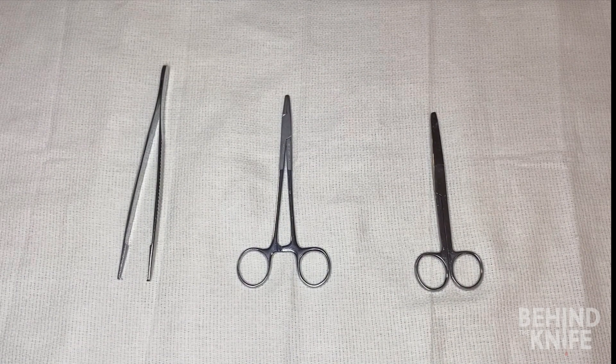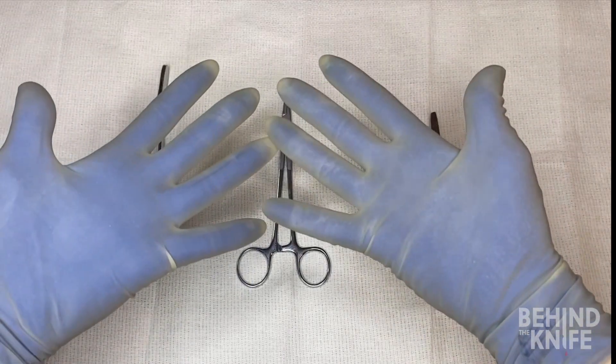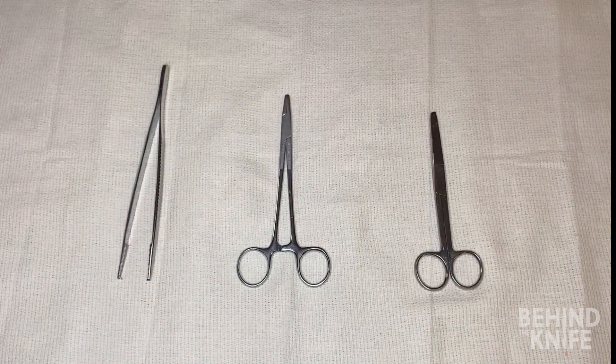Today we're going to review how to hold and use some of the most common surgical instruments. I always encourage students to practice while wearing gloves. The general feel of instruments can change depending on if you have gloves on or not, so it's always best to practice the same way you'll have to execute a skill in the operating room.